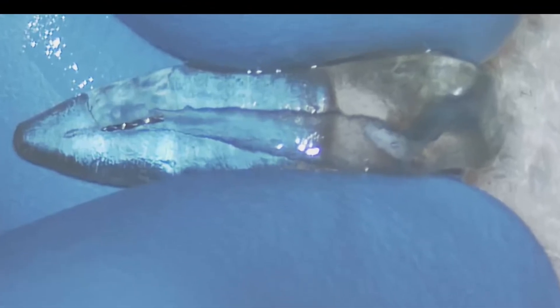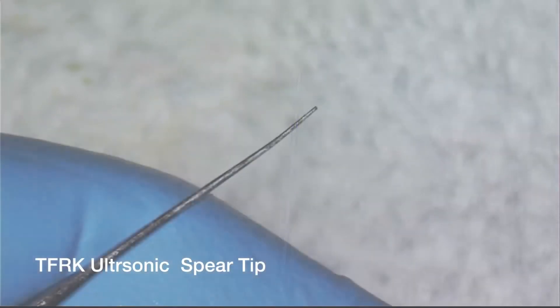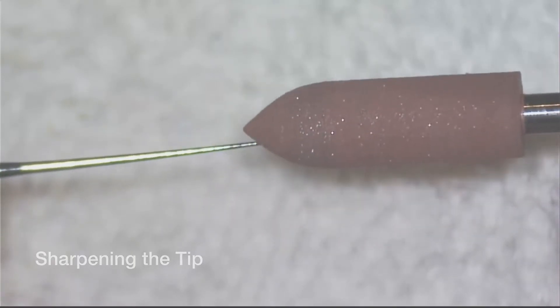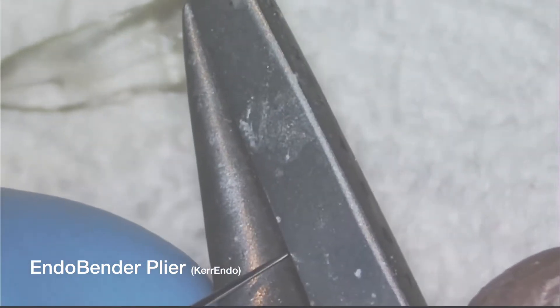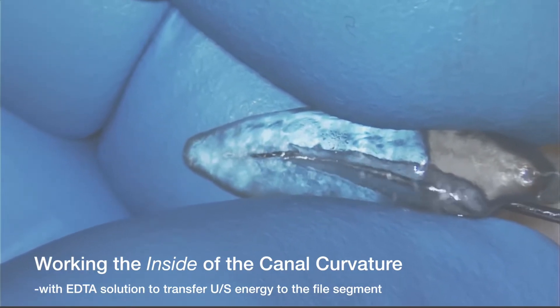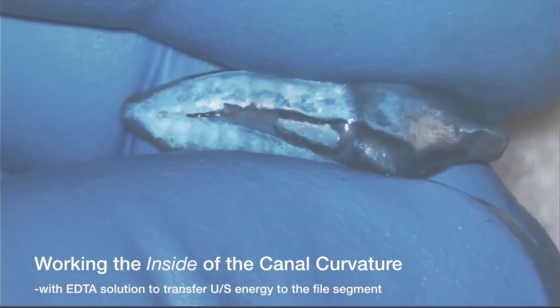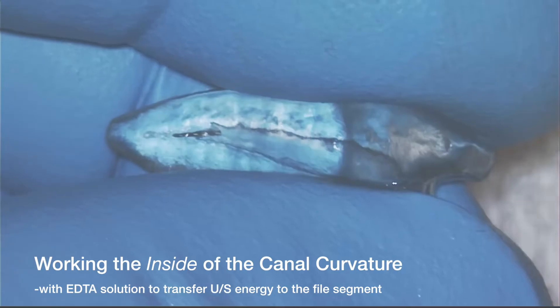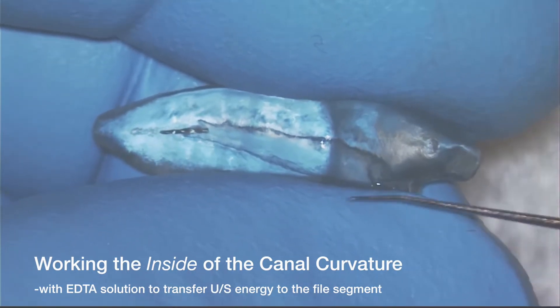You can see with that number twelve in there a really nice trough. Maybe it's time to take it out with the spear tip. These come in a very tiny size, but I like to sharpen them. I also use a brownie point to sharpen the spoons, and then I use an endobender plier to bend the spoon or the spear tip so it's going to go to the inside of the curve. That's one of the critical things that Dr. Taraucci has identified about the necessities of removing separated instruments. Another important thing to do in getting the file to vibrate out is to use the ultrasonic spear tip in the presence of EDTA solution.